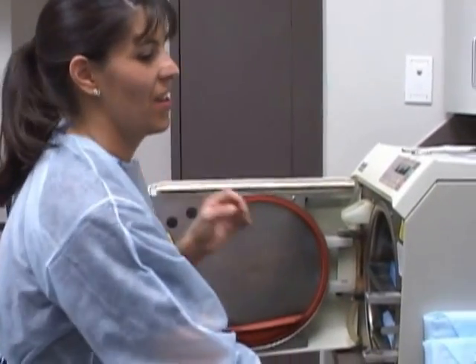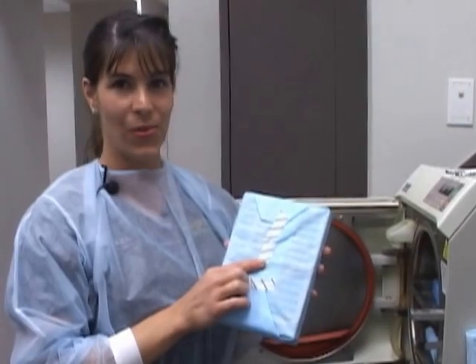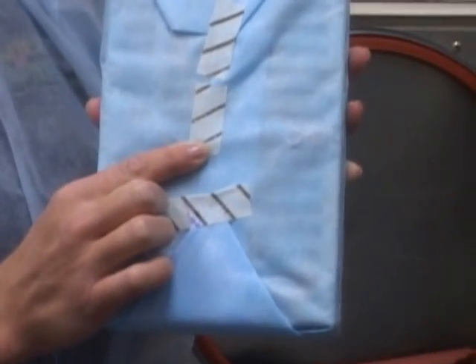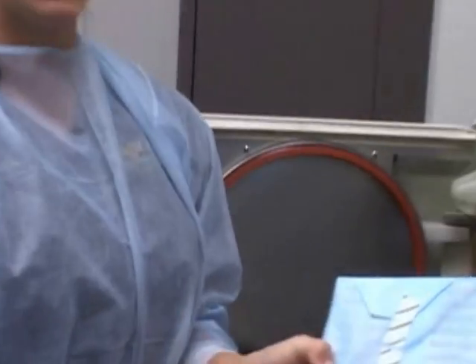Sterilization has finished. Our indicator tape has changed colors, letting us know that sterilization has been completed. And that has been our video of the sterilization protocol here at Smiles of Arlington.